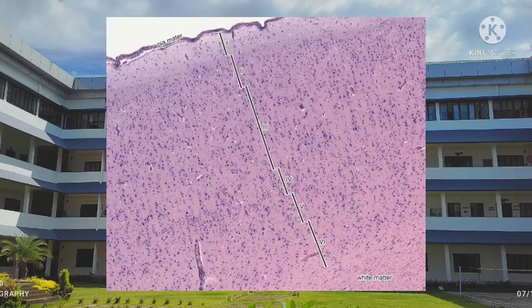In addition to the cell bodies of neurons, the cerebral cortex contains abundant nerve fibers. Many of these are vertically oriented.